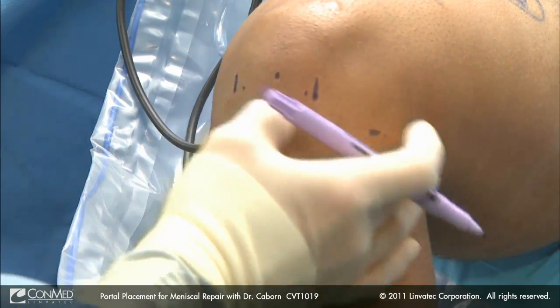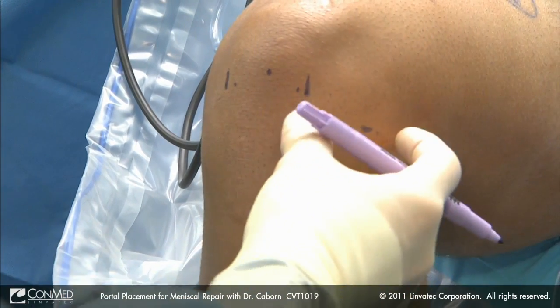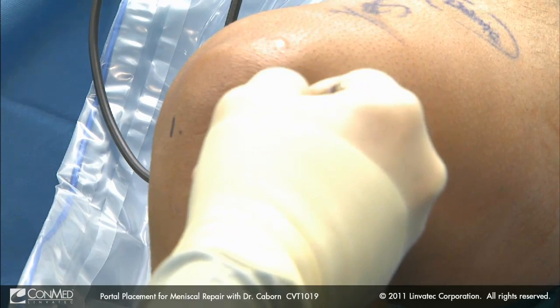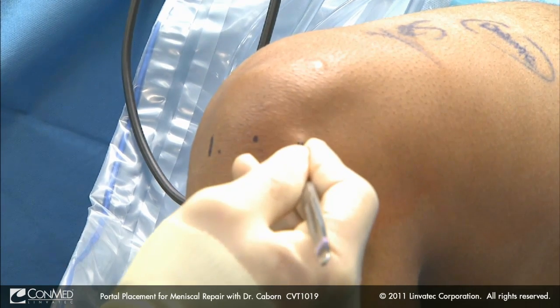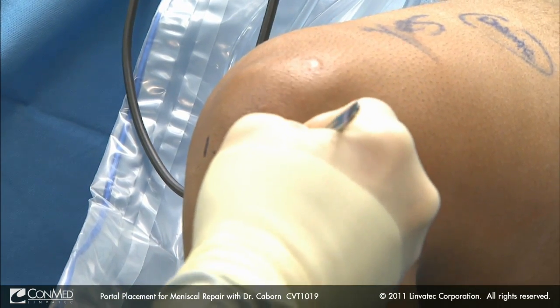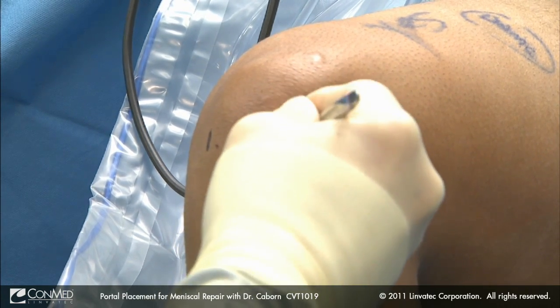We will come about five millimeters off the edge of the tendon into our relative soft spots. I like to go through the skin, then feel the capsule here, pop through the capsule, release the capsule superiorly, and then when I go down, I just push down. I don't saw down because I know I'm close to the top of the meniscus and I don't want to injure that.